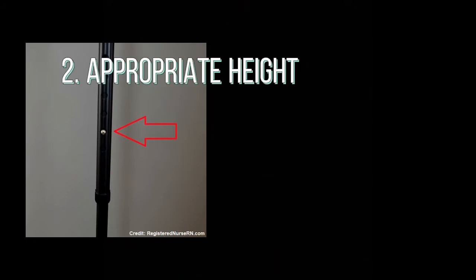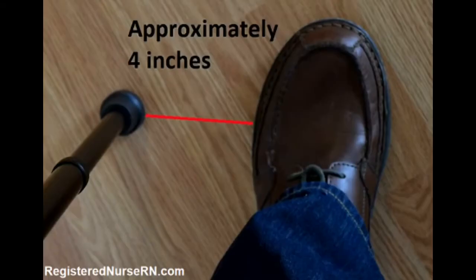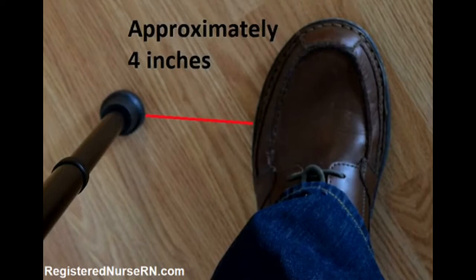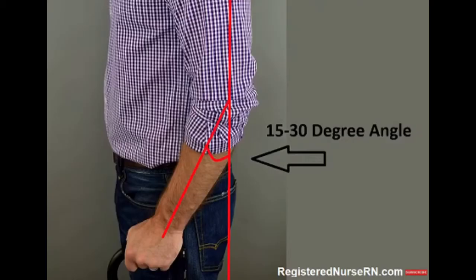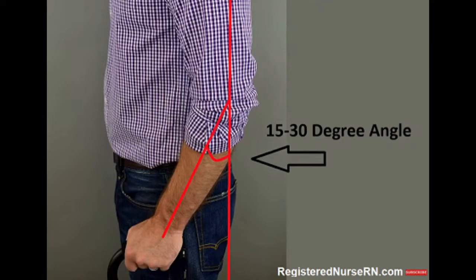For the implementation: first, prepare the client for the procedure. Second, make sure that the assistive device is the appropriate height. Third, make sure the assistive device has rubber tips. Fourth, apply a safety belt if unsure of the client's stability. Fifth, the client should hold the cane on the uninvolved side, 4 to 6 inches or 10 to 15 centimeters to the side of the foot. The cane should extend from the greater trochanter to the floor, allowing approximately 15 to 30 degrees of elbow flexion.